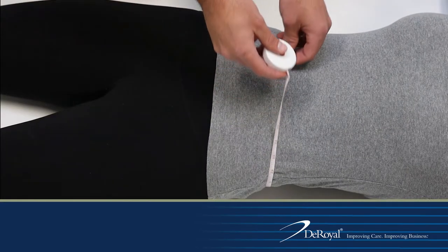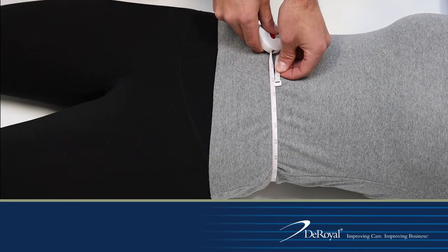Prior to application, determine the appropriate sizing zone by taking the patient's waist measurement at the navel.